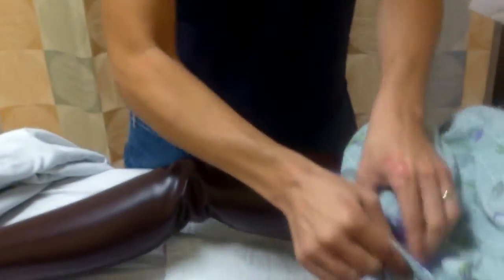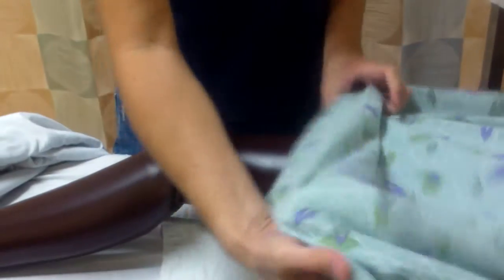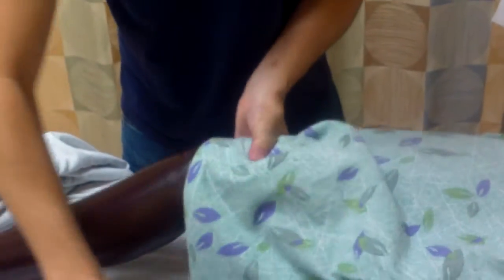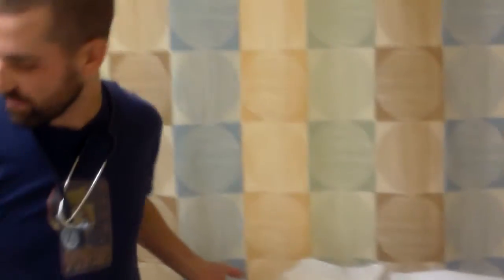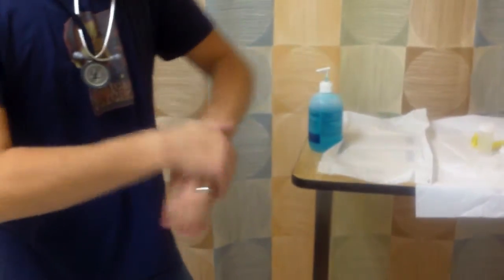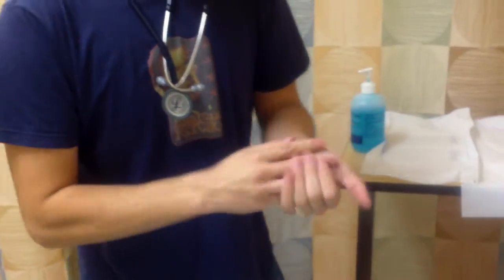I'm going to help him. And I also note in my nurse's notes on how he tolerated the procedure. I would clean up everything, do some more hand hygiene here. Do that. I would make sure that his call light is well within reach. Here it is. Side rails back up. I would also see if the patient needed any other kind of assistance, or if he needed anything rather. And then I would make sure I would document everything.